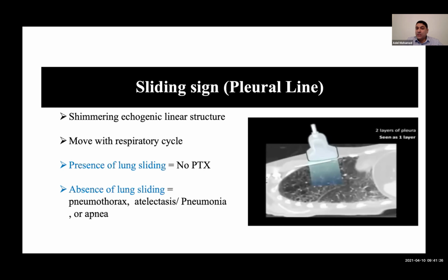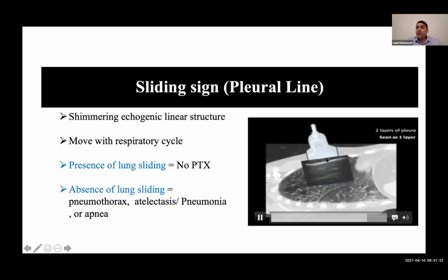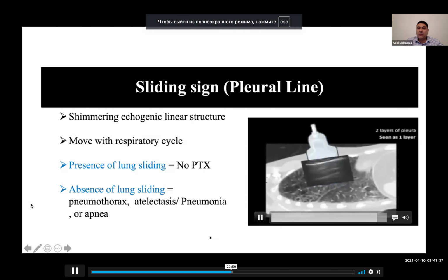So you will not see two lines, you will see one line. Again, this is in real time. You see here the pleural line and it is sliding. We'll talk about this more when we see more videos.